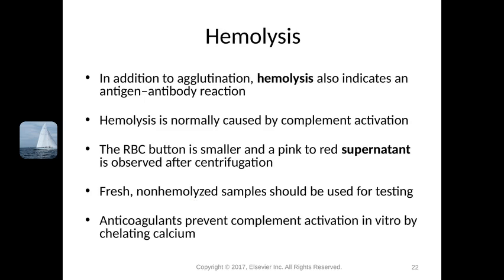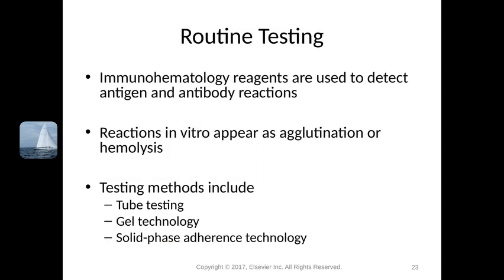So we use reagents to look for antigen antibody reactions. These will appear as agglutination or hemolysis. Our testing for these reactions is done by tube, gel technology, and solid phase capture technology. I've had the privilege to use all three. This one's my favorite, by the way. The solid phase capture is really cool.